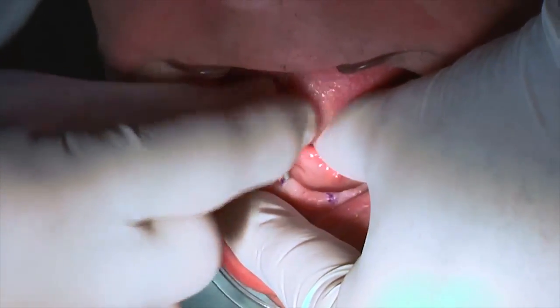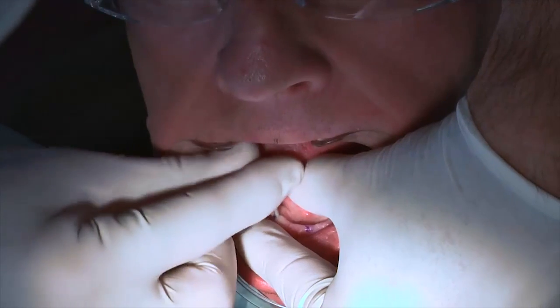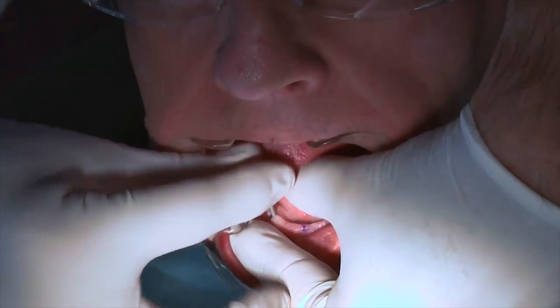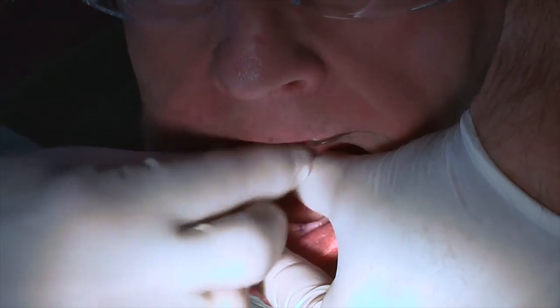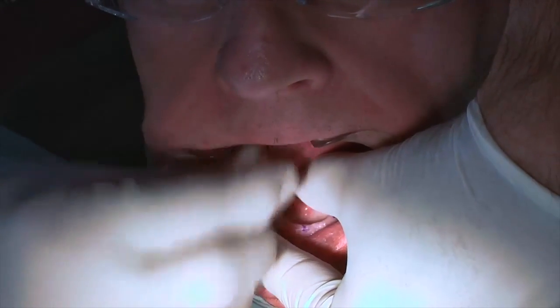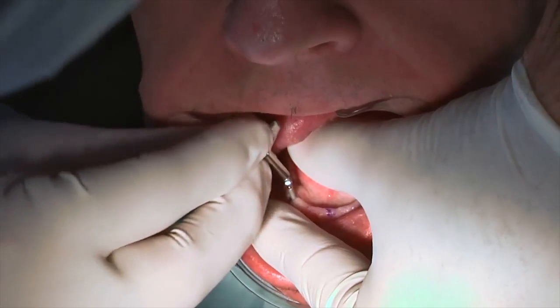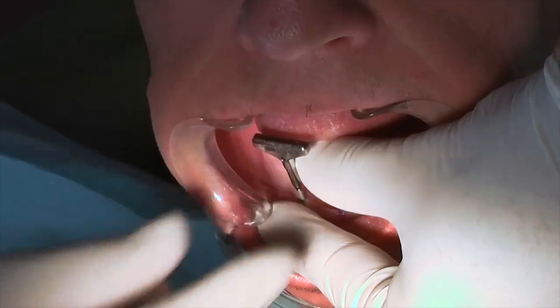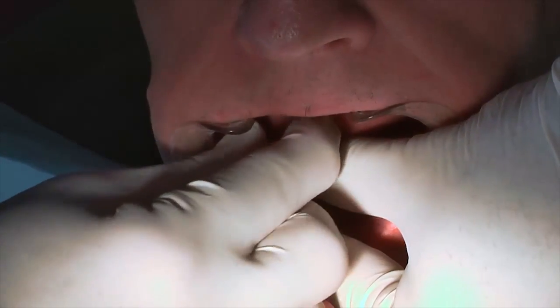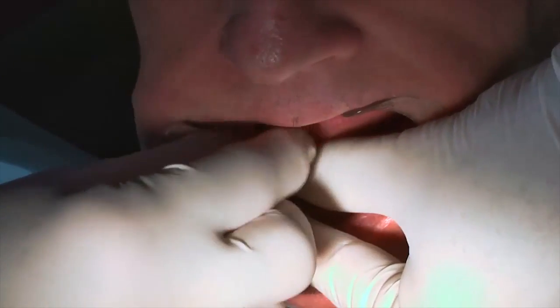Remove the cap and attach the finger driver. Drive the implant into the pilot opening and advance until you notice resistance to the clockwise turning. Remove the finger driver and use the winged thumb driver to advance the implant deeper into the bone until increased resistance is felt. If the implant turns easily, there may not be sufficient bone density to securely place or immediately load the implant, and an alternate size, soft reline, or discontinuation of the procedure should be considered.